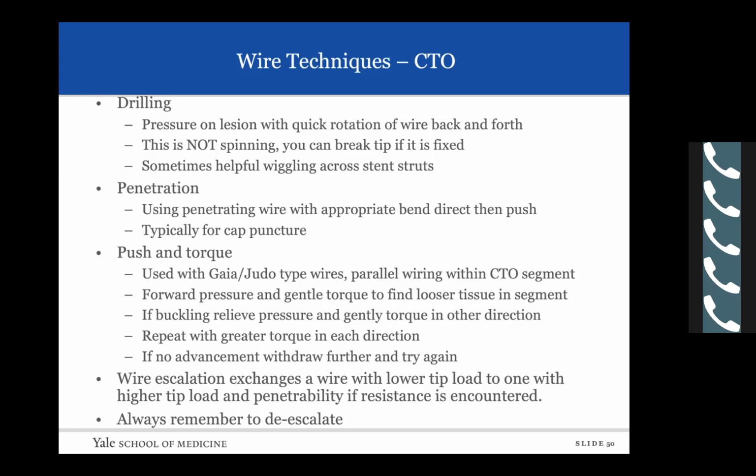Wire escalation, we've all kind of done this. You start with a soft, simple wire, you escalate to a heavier gram tip, and then a polymer jacketed, and then a penetration wire. But the key with all of these things is just like your guide, you want to de-risk your guide. If you're really buried in there, you want to de-escalate your wire to a safety wire once you've done what you want to accomplish.